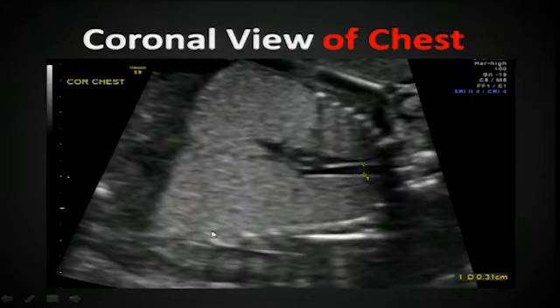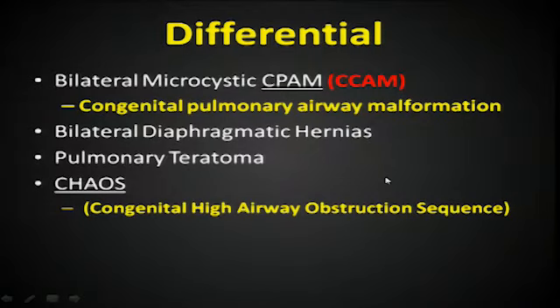And I'm going to do a coronal view of the chest, so we're looking from right side to left side. Look at the diaphragm, kind of bulging out, downward, displaced inferiorly. And then looking at this, what do you think this could be? This dilated structure coming from the area of the neck down into the chest. It's a dilated trachea.